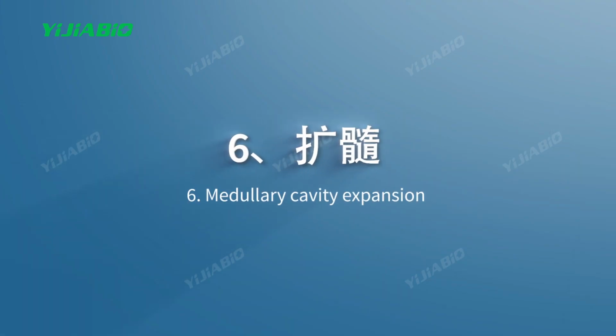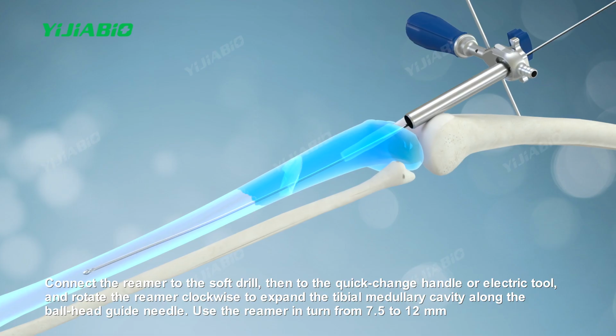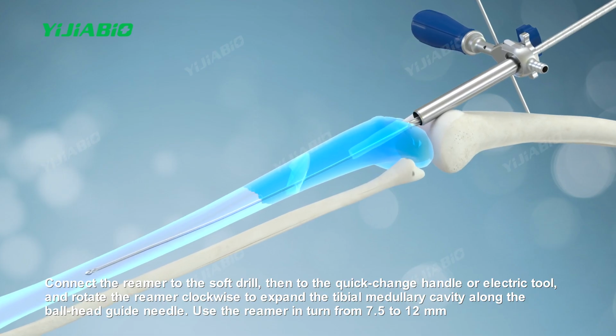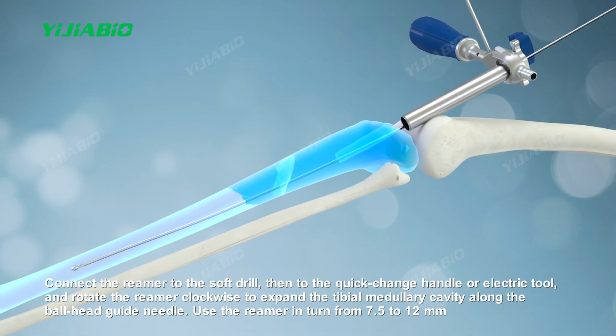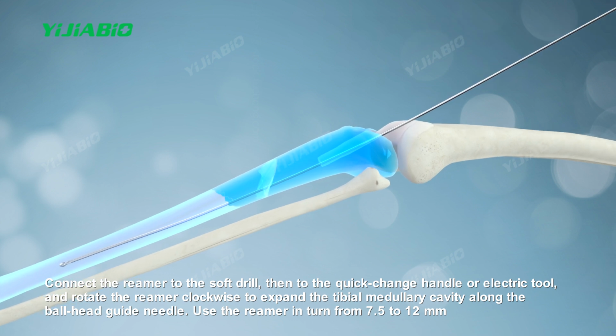Six, medullary cavity expansion. Connect the reamer to the soft drill, then to the quick change handle or electric tool, and rotate the reamer clockwise to expand the tibial medullary cavity along the ball head guide needle. Use the reamer in turn from 7.5 to 12 millimeters.